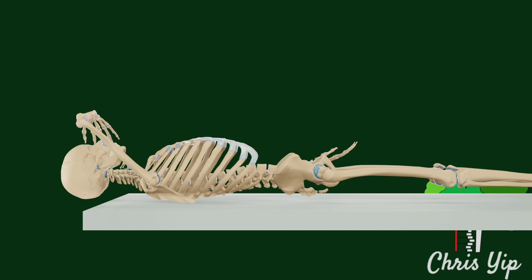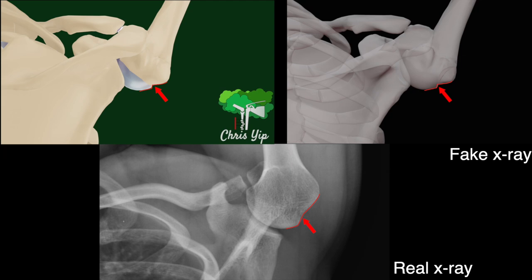The x-ray cathode is positioned 10 degrees cephalad, and the resulting image from the opposing side will show the Hill-Sachs defect as a notch in the lower lateral border of the humeral head. Other structures that can be seen include the spine of the acromion, the acromion itself, the coracoid, and the clavicle.